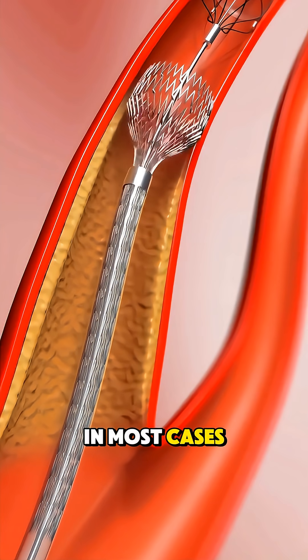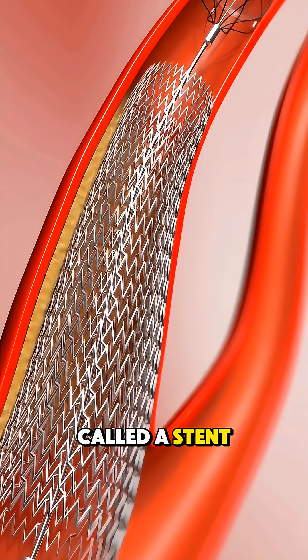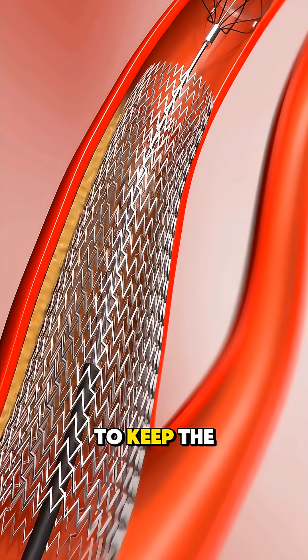In most cases, a tiny metal mesh tube called a stent is placed at the same time. The stent expands with the balloon and stays behind to keep the artery open.